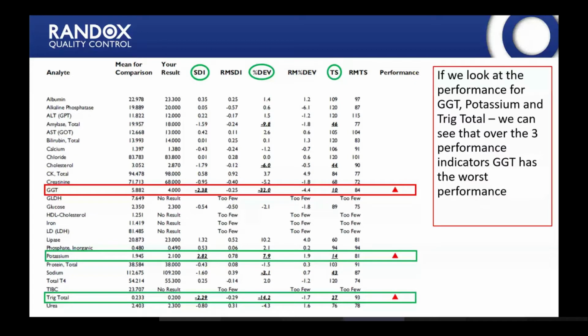So if we look at these three, we're going to need to see, is it just this one sample? Is it a long-term issue that we have? If we look at this particular sample, we can see, looking at the three different performance indicators, GGT is the worst performing. Its SDI is greater than 2, our percentage deviation is out, and our target score, so 10 is the lowest target score that you can get. As Stephen said, the target score ranges from 10, your worst performance, to 120, which is your best performance.